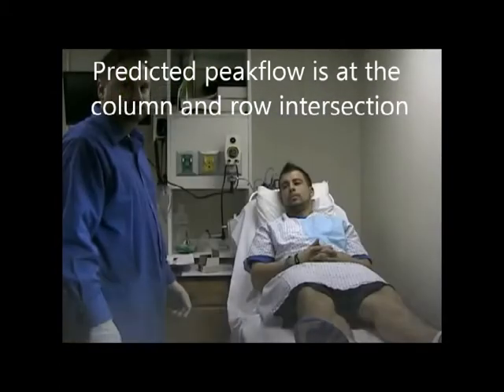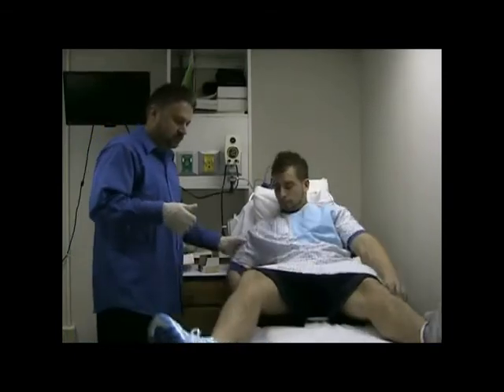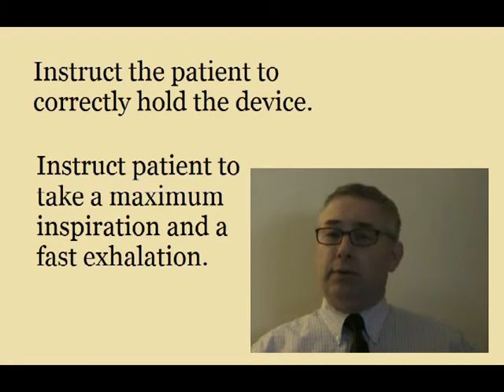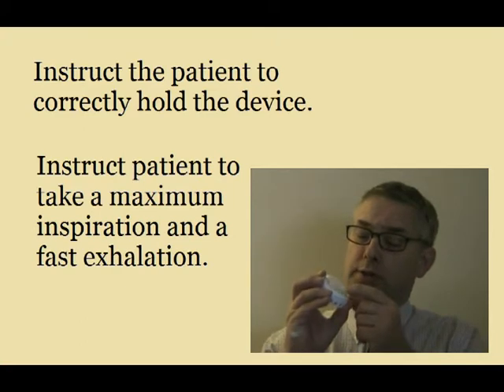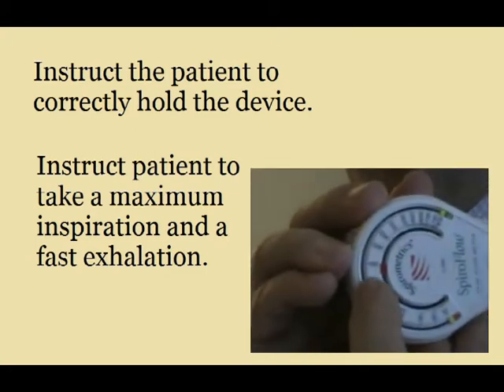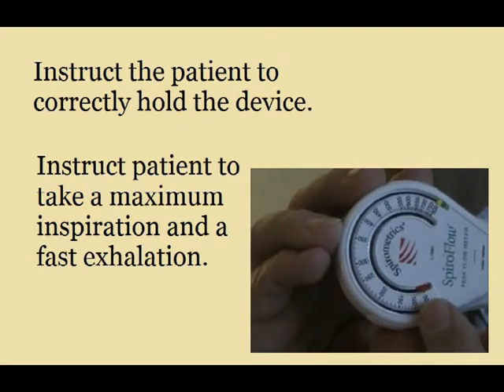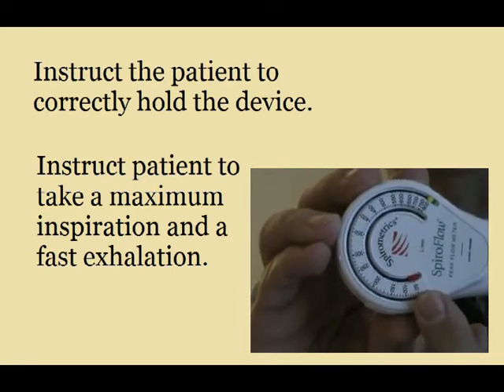Next, get the patient in the best possible position, such as sitting on the side of the bed or standing up. I'm going to have you sit on the side of the bed here. When you do a peak flow, you'll start with one thing first: take and set the indicator back to zero. We will move that red dot all the way down to the lowest possible reading — in this case, 50 liters per minute.